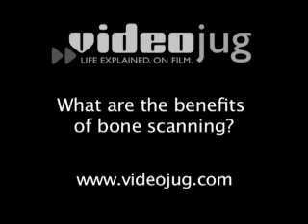What are the benefits of bone scanning? Similar to the other procedures in general nuclear medicine and in PET, the benefits of bone scanning are tremendous because it tells us, depending upon what the disease process is that we're looking at, a good amount of diagnostic information which is important in the care for the patient. For example, in tumor scanning, we are able to find out what the extent of the disease is to the bone from a primary tumor, and that can impact treatment in that patient.